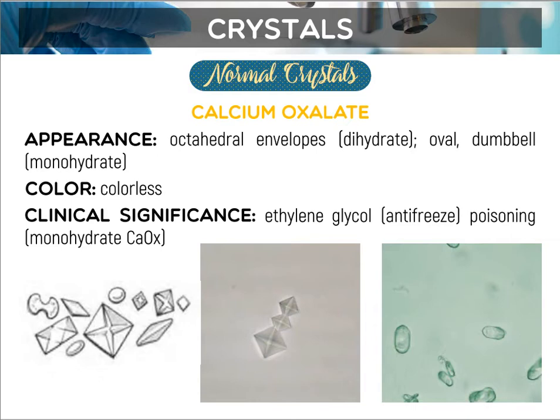And then its color is colorless, of course. Clinical significance, it's ethylene glycol poisoning. So basta ethylene glycol gani siya guys, mo ni inyong dumbbell or your monohydrate. Okay guys, if fresh gani na urine atong makita, like fresh urine atong gitest.